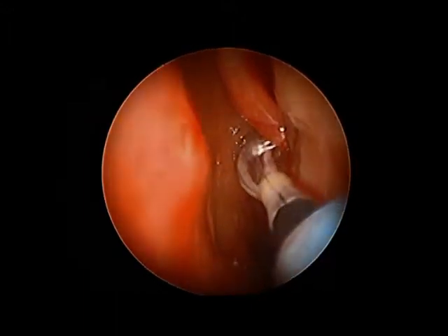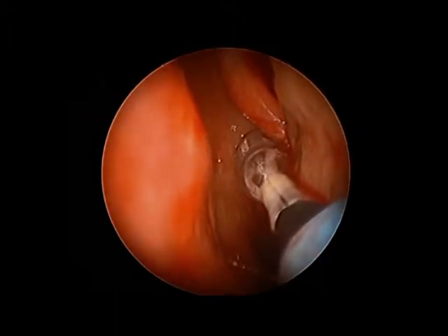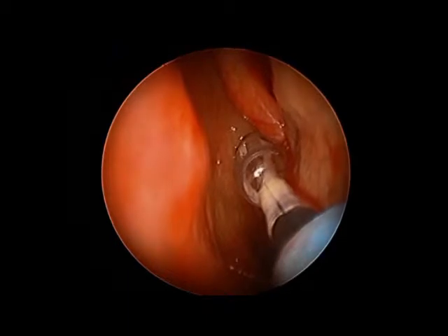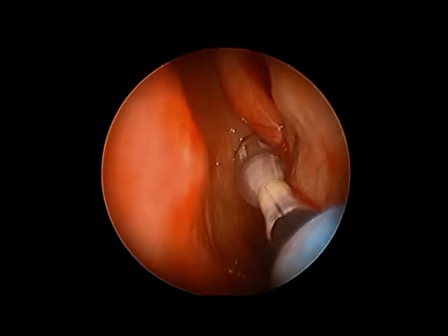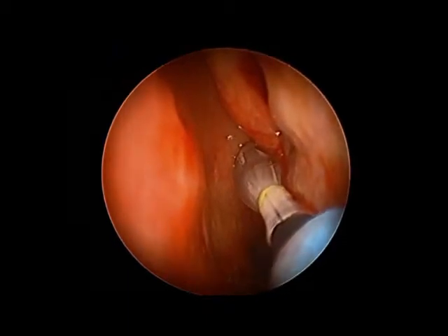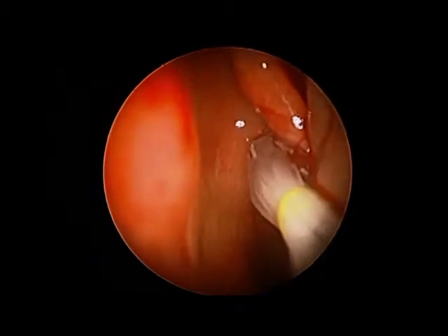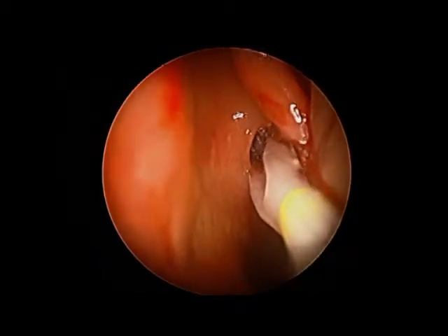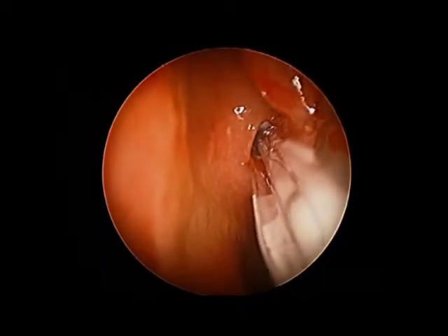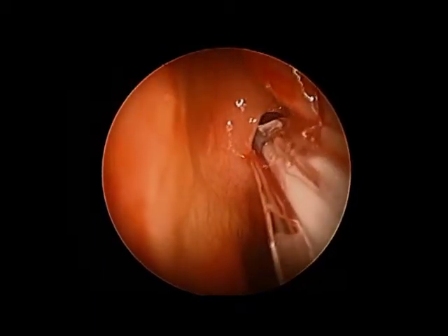The balloon is then gently inflated, and once it's deflated and removed, you can see the much wider opening into the sphenoid sinus.